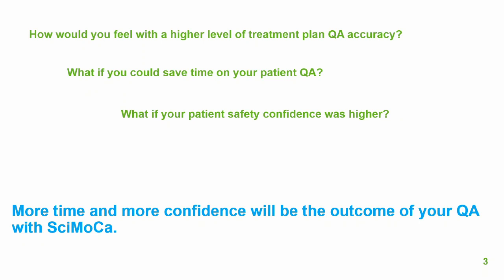How would you feel with a higher level of treatment plan QA accuracy? What if you could save time on your patient QA? What if your patient safety confidence was higher? More time and more confidence will be the outcome of your QA with SciMoCa.